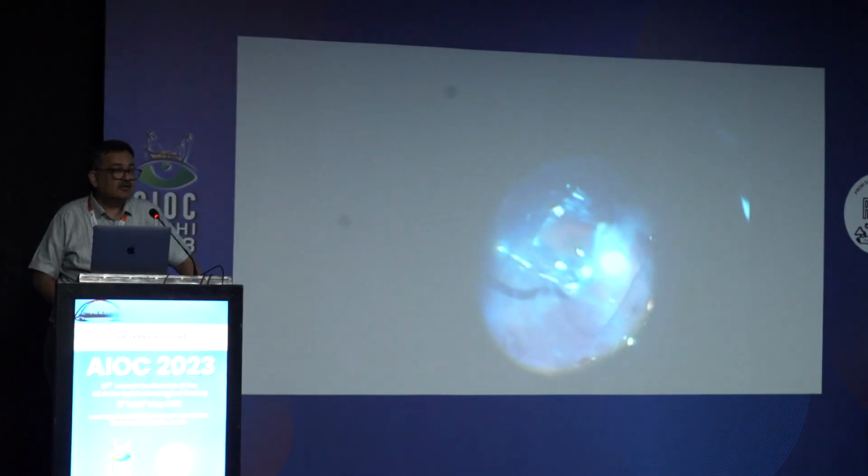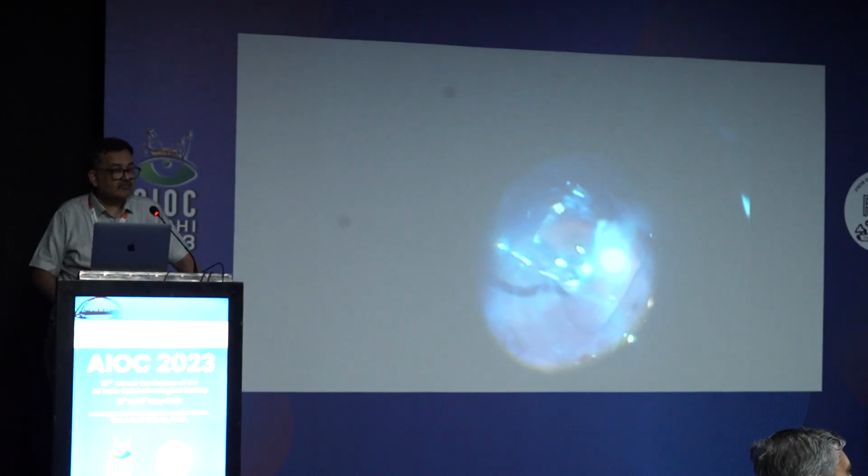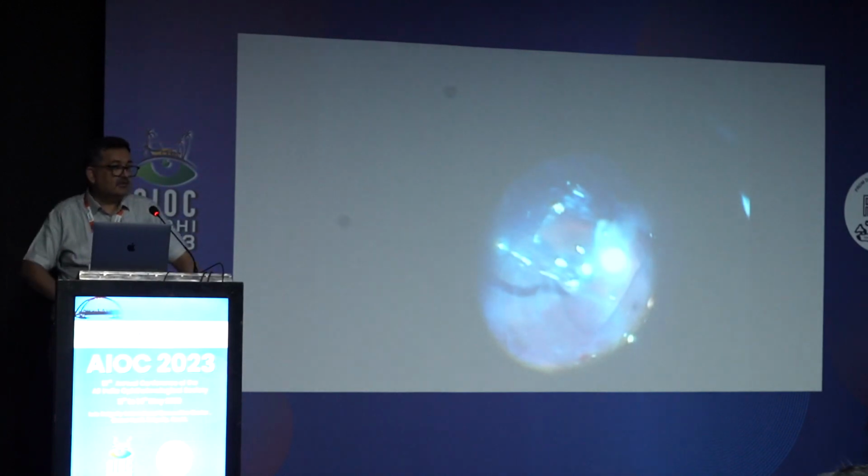Agree with that one. So probably that is an area where the RPE pump is not that actively functioning. Now it's difficult to answer that question exactly. But more or less, generally when you see this, the area which was detached, fluid comes back there again. Even if it was drained flat, some SRF would have been left behind, because knowing this SRF, it would have been very thick and viscous.